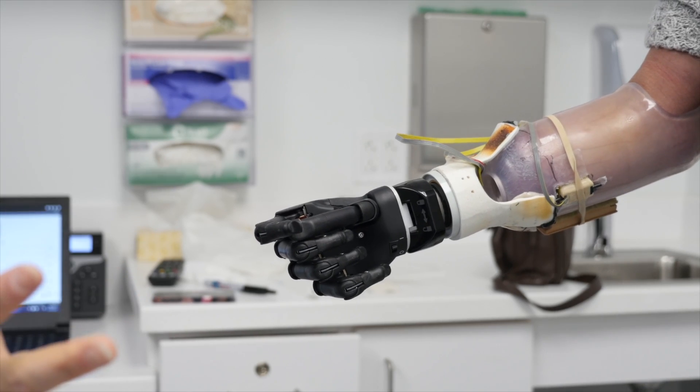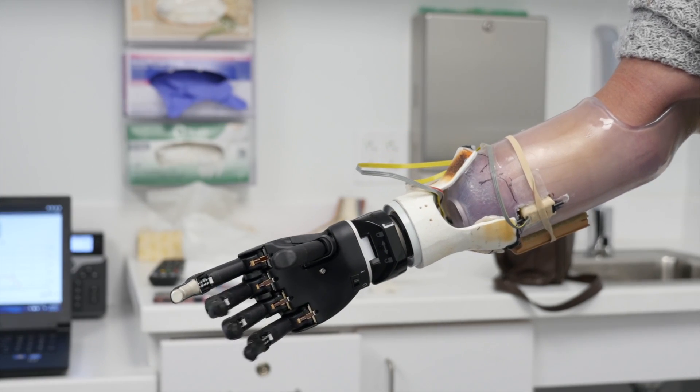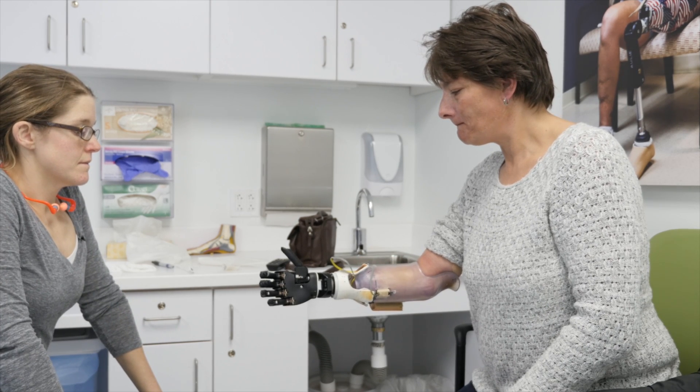It's not just learning how to use the hand. It's also making my arms stronger and working the muscles so I can hold up the socket and wear it. Anybody that I've come in touch with here — personally or just walking by, not knowing a person — they're just friendly and they work and they help you. I can't say enough. They're just angels.